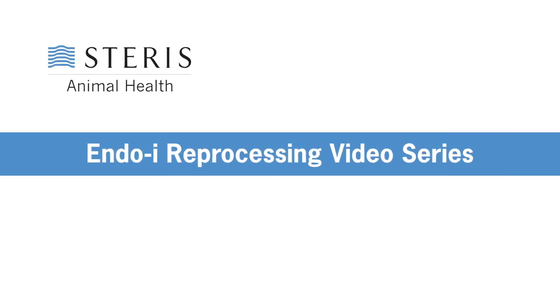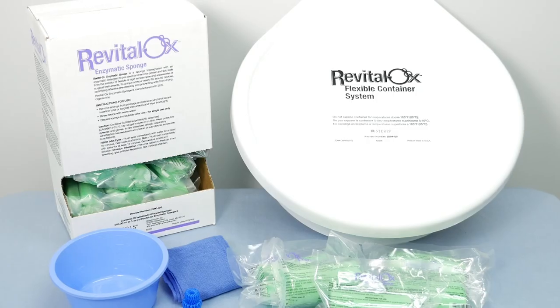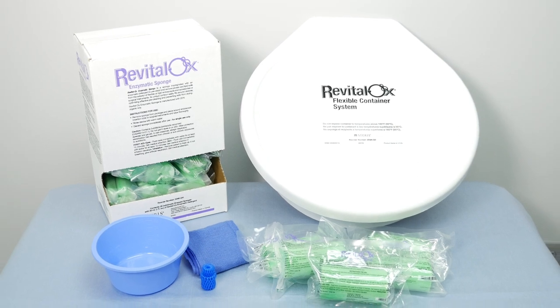Welcome to the Steris Animal Health Endoscopy Reprocessing Video Series. Step 1 uses the Revitalox Enzymatic Sponges and the Revitalox Container System.